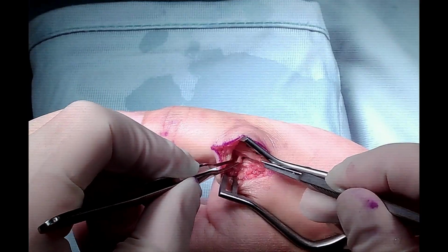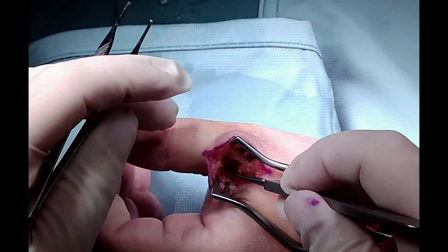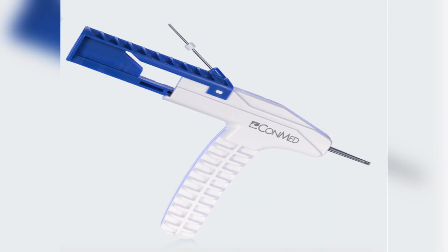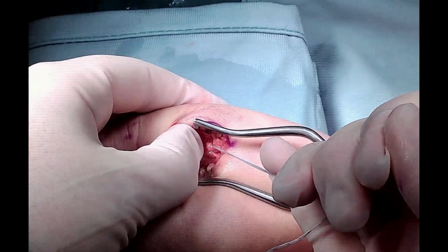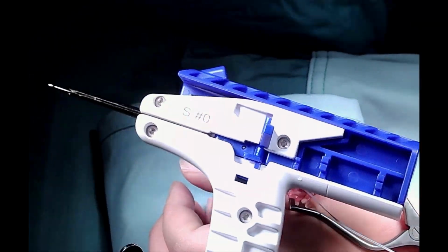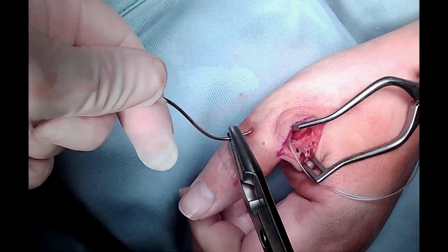And to be exact, we utilize a 1.7 millimeter Conmed True Shot anchor that we see here. It's a simple mechanism to use. We put it exactly at the point of avulsion. It needs 10 millimeter depth of K-wire advancement, and we can see here that we have 2 FiberWire sutures.